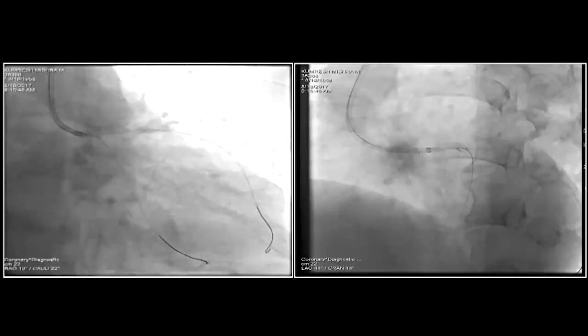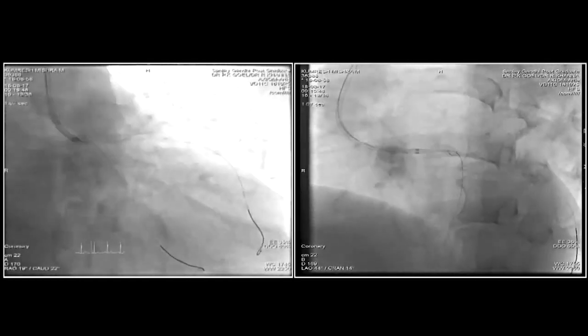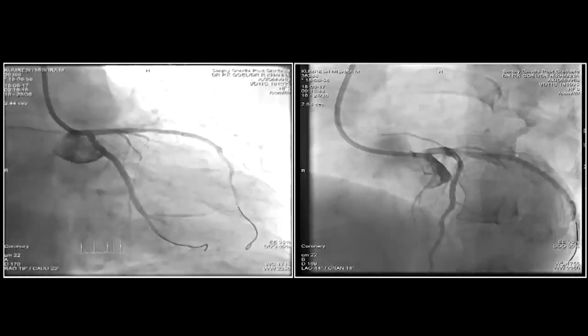Yes, sir. Inject. Rather, it can create more mess than the other way around. Looking good, sir. But I think you see the AP card, before you do POT, it's looking good. So rewire through the left main before you do 4.0 POT? No, I am not going to rewire before I do POT.